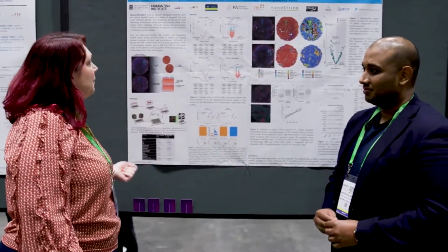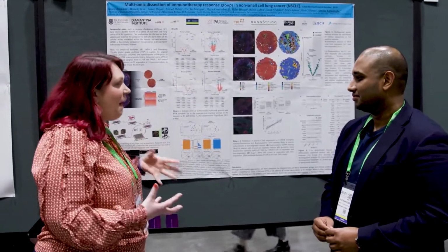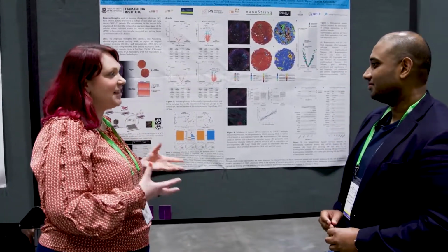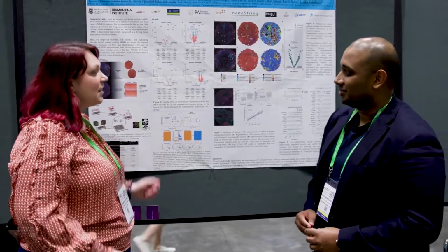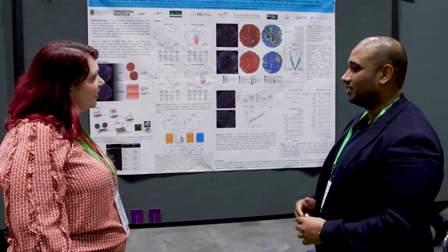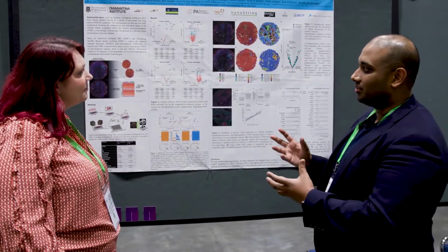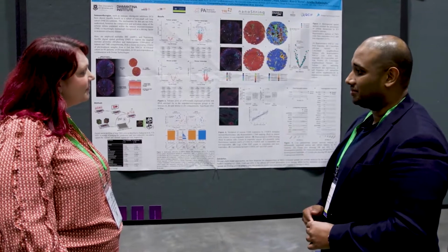So Arutha, tell us a little bit about your poster. Why did you choose a spatial biology platform to analyze these non-small cell lung cancer samples? Yeah, great question. One of the challenges in immunotherapy at the moment is there's a lack of predictive biomarkers. So we thought that spatial could potentially help in that space.